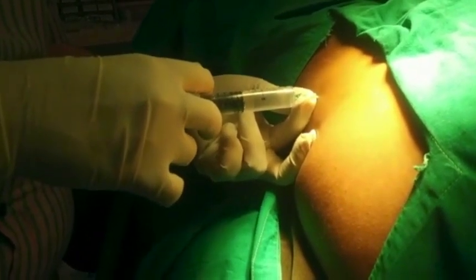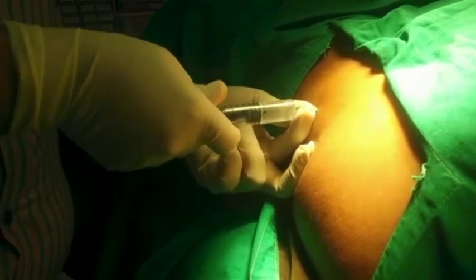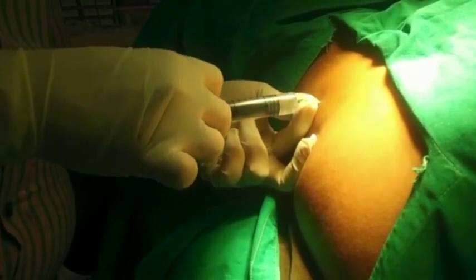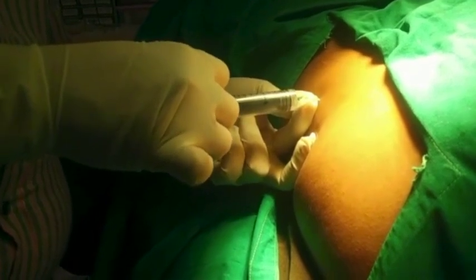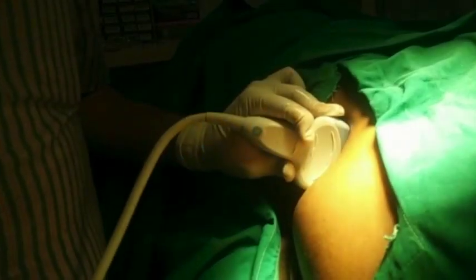After every 5 ml of injection, always aspirate to check for any intravascular injection. There is a branch of the deep circumflex iliac artery in this plane, so be careful. After giving the injection, I confirm with the ultrasound.